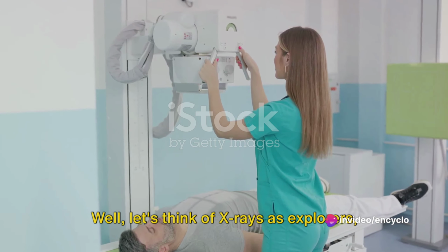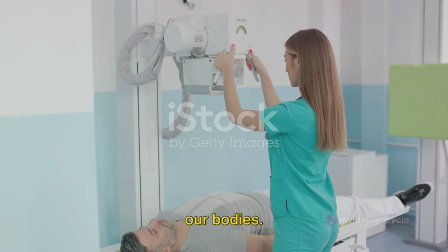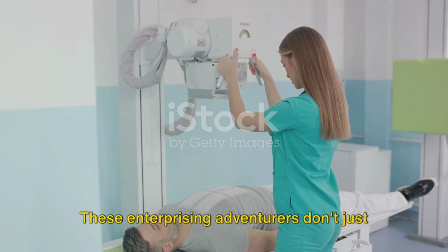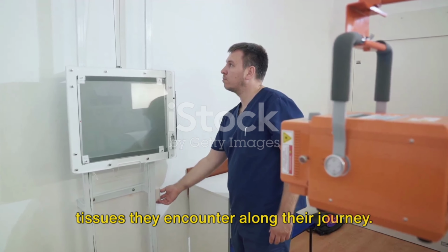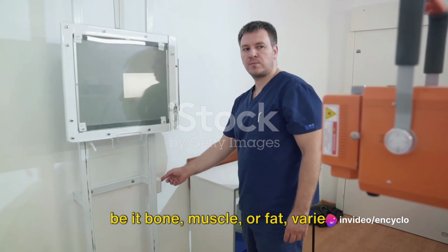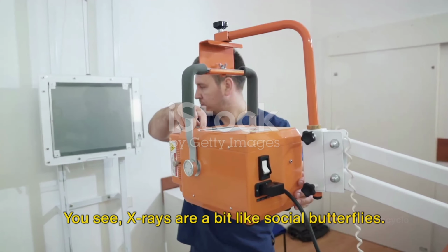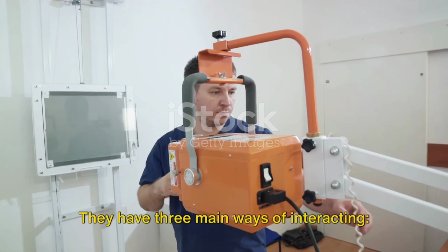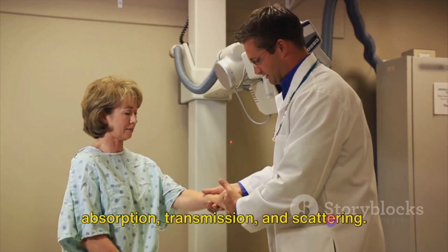Now we have our X-rays, but what happens when they meet the human body? Well, let's think of X-rays as explorers, venturing into the unknown territories of our bodies. These enterprising adventurers don't just pass through, they interact with the tissues they encounter along their journey. Their interaction with different tissues, be it bone, muscle, or fat, varies. You see, X-rays are a bit like social butterflies. They have three main ways of interacting: absorption, transmission, and scattering.